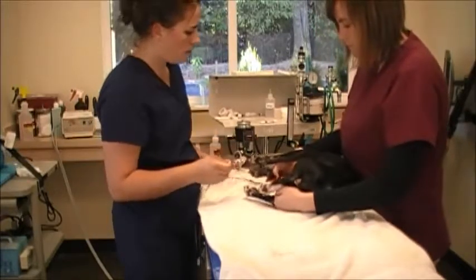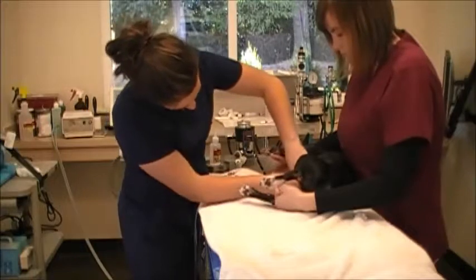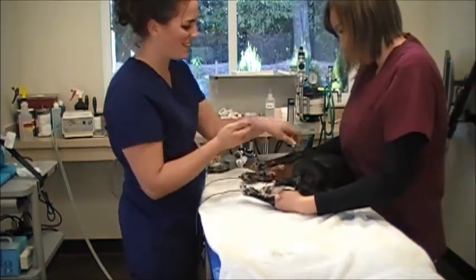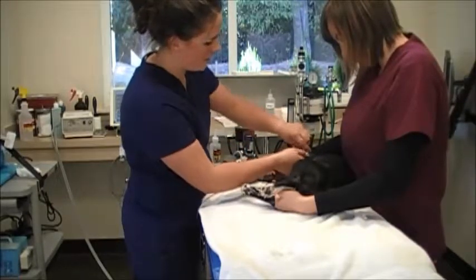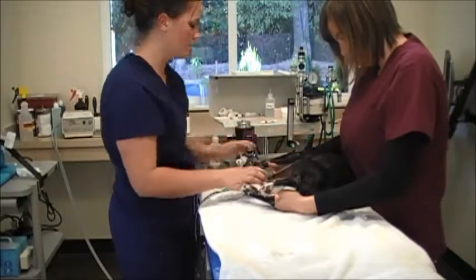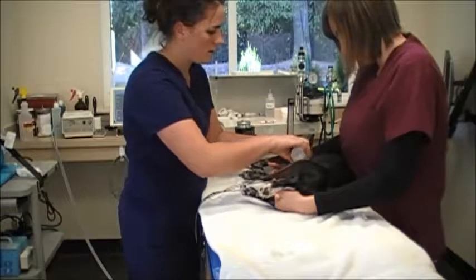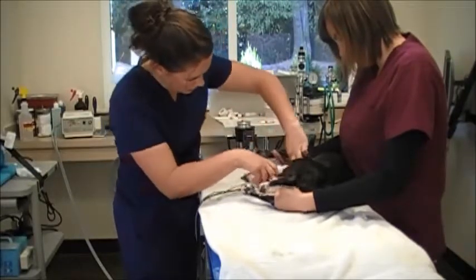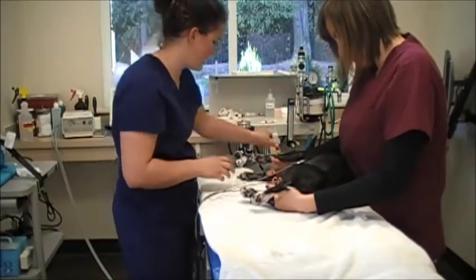The white lead is going to go on the right arm or foreleg — that's on the downside — clamping it to the skin kind of behind the elbow. And then the red lead is going to go on the left leg. Once my leads are all in place, I'm going to use alcohol just as a conductor, putting a little bit on each lead, similar to an ultrasonic gel that will conduct the electrical activity.